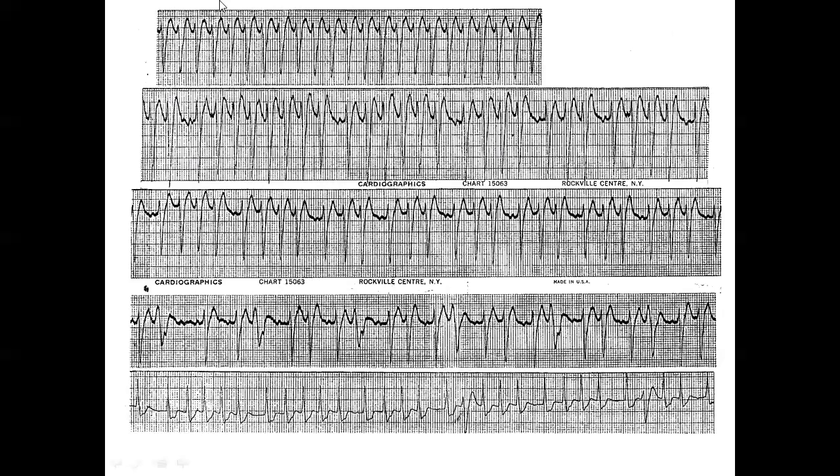So this is a patient in atrial flutter. When you slow down the flutter rate with antiarrhythmics, you can easily slow it from 300 to 250 or 200 or even 180. And the AV node, which was not able to conduct 1-to-1 at 300 per minute, now is able to conduct 1-to-1 at, say, 220 or 200 per minute. And it is doing it 1-to-1, but eventually the AV conduction system poops out, and it can do it for, say, 7 beats, then couldn't do it anymore.